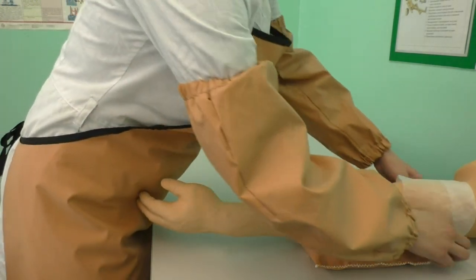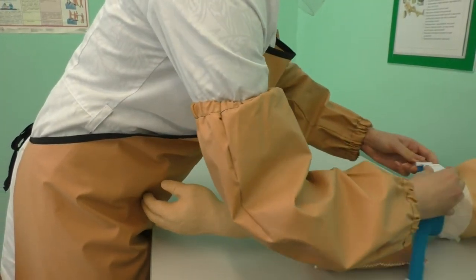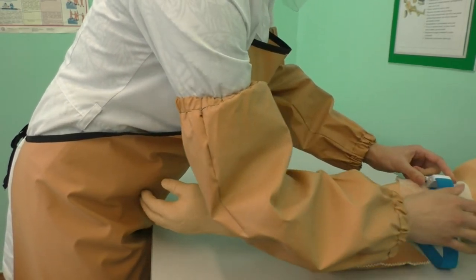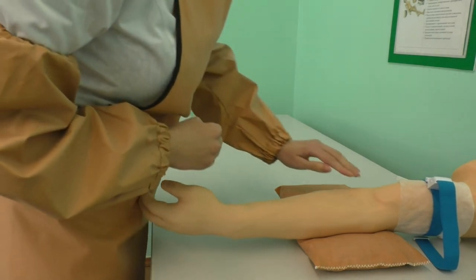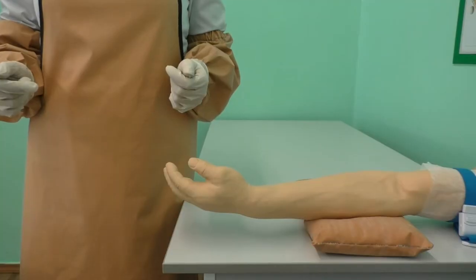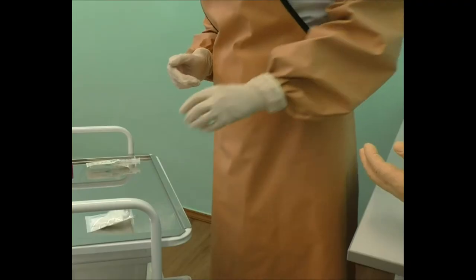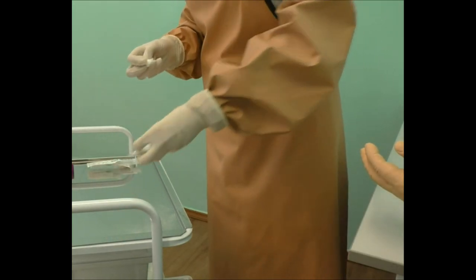Position the patient and hyperextend the patient's arm. Place the phlebotomy arm wedge under the patient's arm. Apply the tourniquet on the arm over a napkin, seven to nine centimeters above the selected site. Closely monitor the arm to ensure it is not applied too tight for more than two minutes.